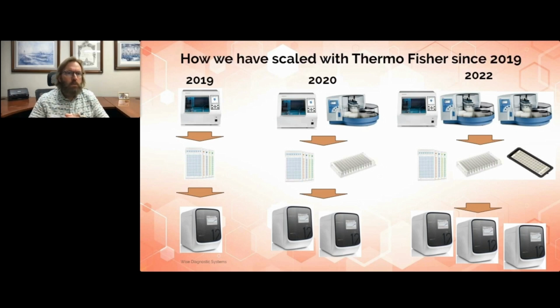And so we went out the gates with the Duo Prime, which has the ability to do about 12 extractions at a time, and a Quant Studio. And then we use the TAC card system, which is a really elegant system that has these cards that you're able to do your positive and negative control and still build in a custom panel on there. So we had the ability to run about 6 tests per card that included both the pathogens that we were going to detect, and also we simultaneously ran the antibiotic resistance markers at the same time.